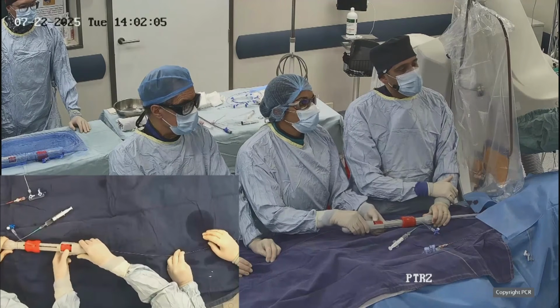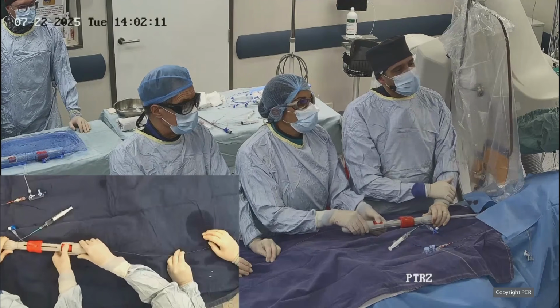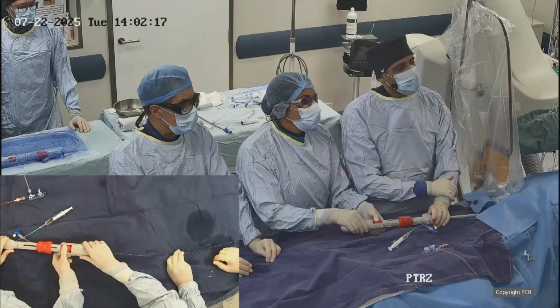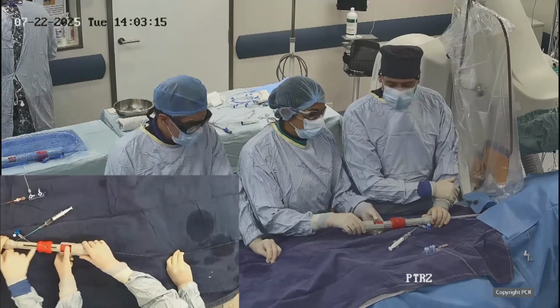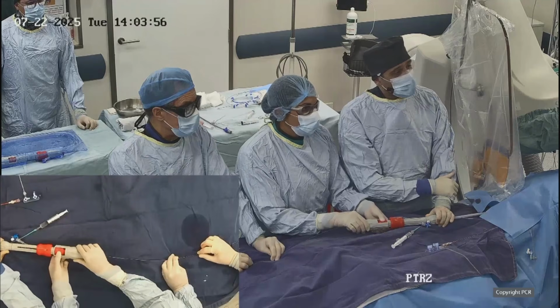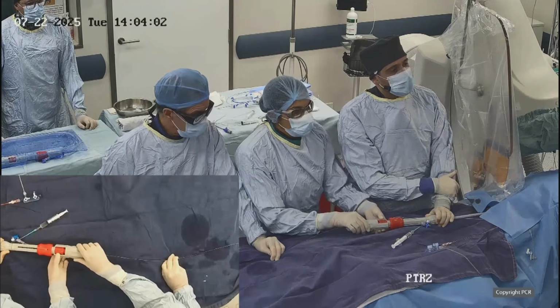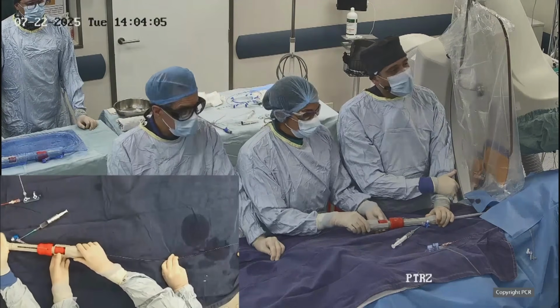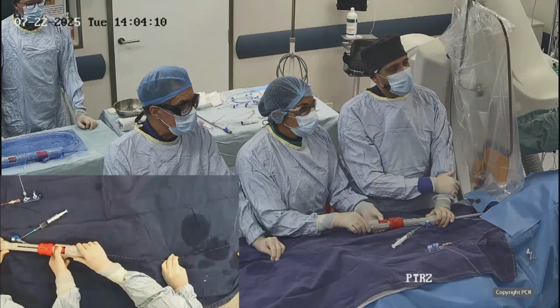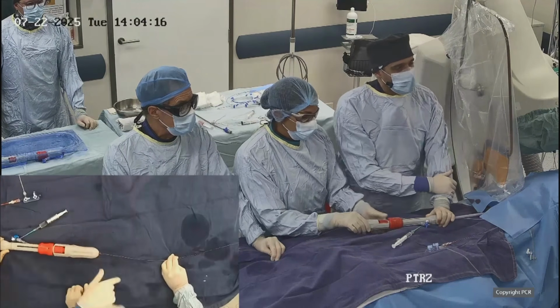Now you are going to see that the device is opening the upper crown, perfectly smooth. I am about to deliver the system. We are at about 70% of the releasing, so we are okay. Now we are at about 90% of the releasing part, so we can now go back. And now we are going to release scroll by scroll, because we want a very controlled releasing. Perfect.